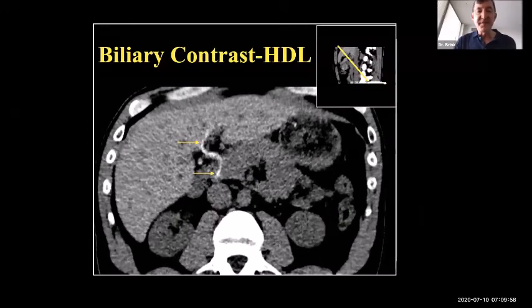This is, I'm embarrassed to say, in fact my bile duct from when I wanted to go to the RSNA many decades ago, before we were terribly concerned about radiation. My friends and I all ingested calcium ipodate granules to opacify our bile ducts. This was the very early days of trying to do CT cholangiography, clearly not recommended.